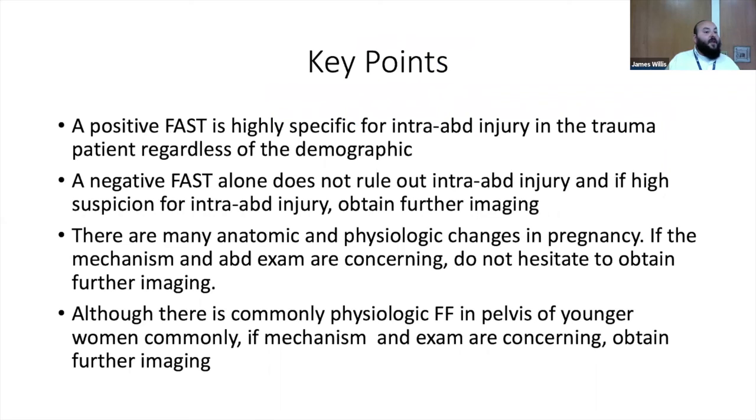Key points that I would like you to take away from this talk is that a positive FAST is highly specific for intra-abdominal injury, regardless of the demographic, whether you're talking about adults, children, pregnant, young women. Positive FAST, be concerned. A negative FAST alone does not rule out intra-abdominal injury. If you have a high suspicion, you must obtain further imaging.